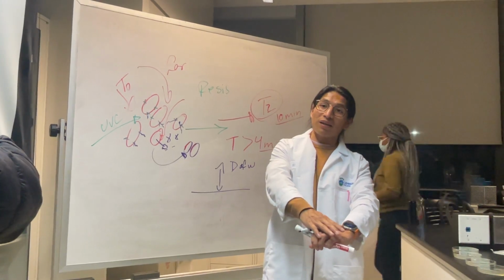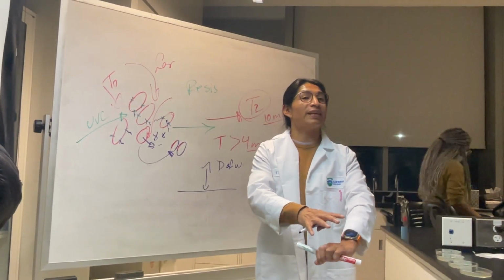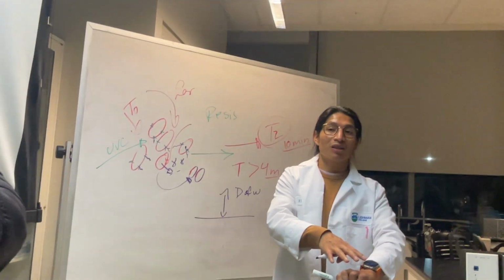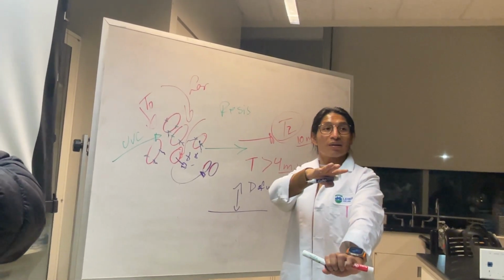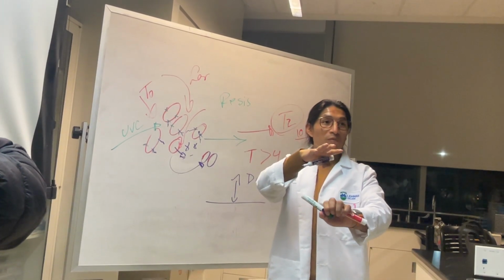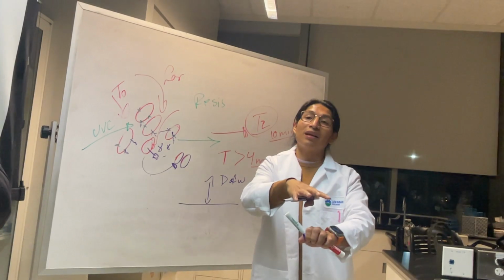The closer it is, the more effective it will be, because you are also releasing heat, not just wavelength. Wavelengths release heat, so that heat could also be contributing to it. So the farther you are, the less effective it will be and the more time you might need. The closer you are, you may be more likely to kill things, but might need less time.